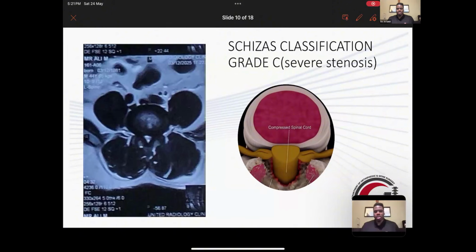Thank you for that summary, Dr. Pittman. Appreciate it. We have a question in the chat. Want to know if the pathology was 2 or 3 levels, would we still be thinking about doing this endoscopically? Has anybody had success doing that, or does that change your algorithm altogether on which tools to use in a toolbox? I guess, what are the limitations, and are there levels of limitation to whether or not you use endoscopic techniques?